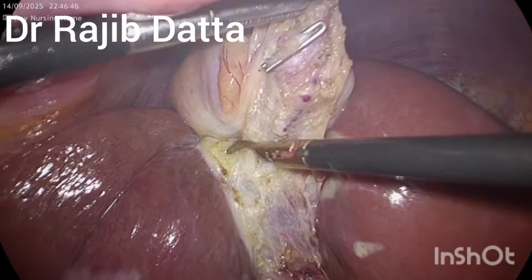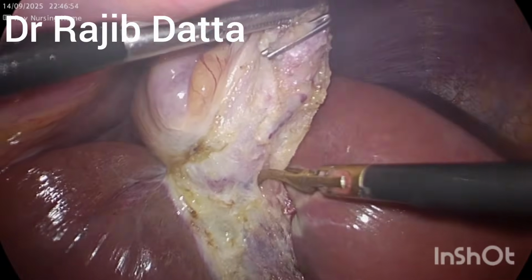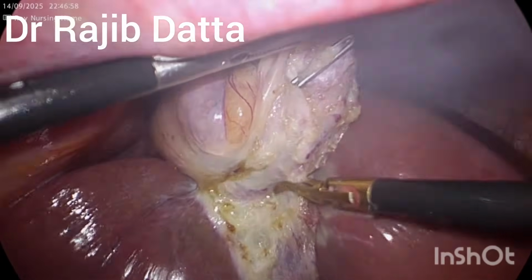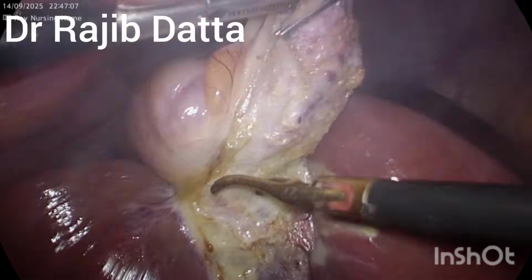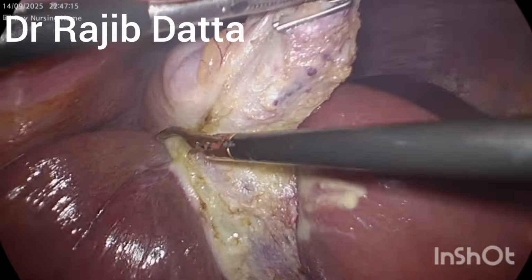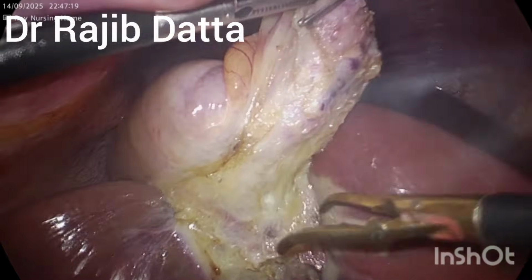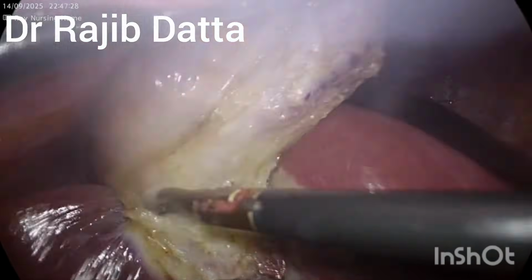Almost the last one third of the gallbladder towards the fundic area is just remaining, and now it is being separated out. The diathermy setting remains low at 25 watts, so less fumes will be generated and less visibility problem will be encountered.